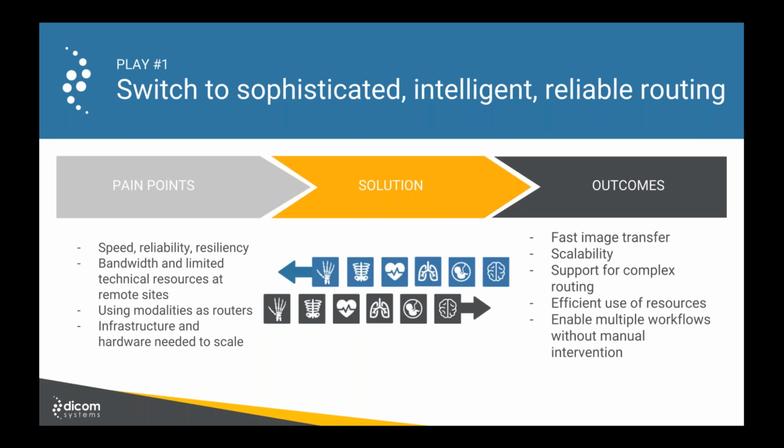So what we did was we put a Dicom Systems device between the CRs and the Fuji PACS, and we were able to fork a copy of the pre-modified images, the pre-reformats, to Foundation, and then the PACS platform at the client hospital was still able to get the same data.